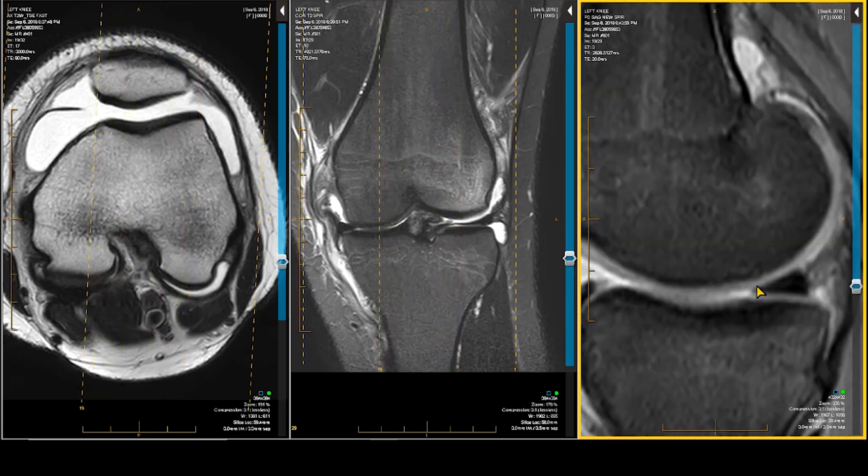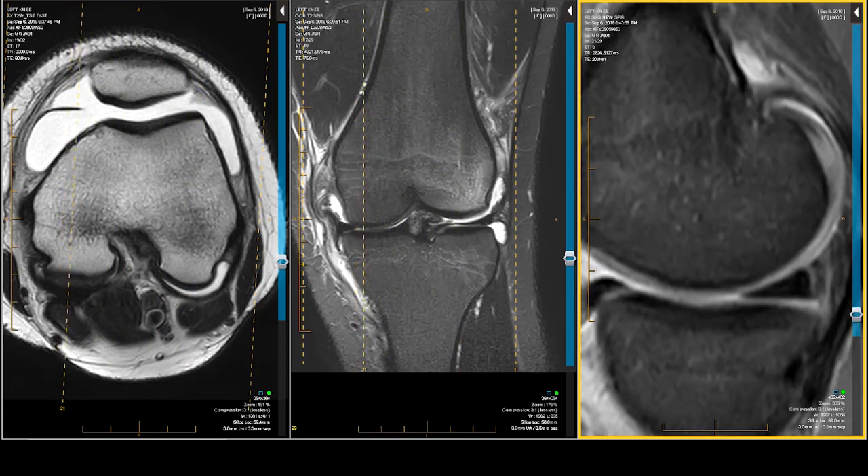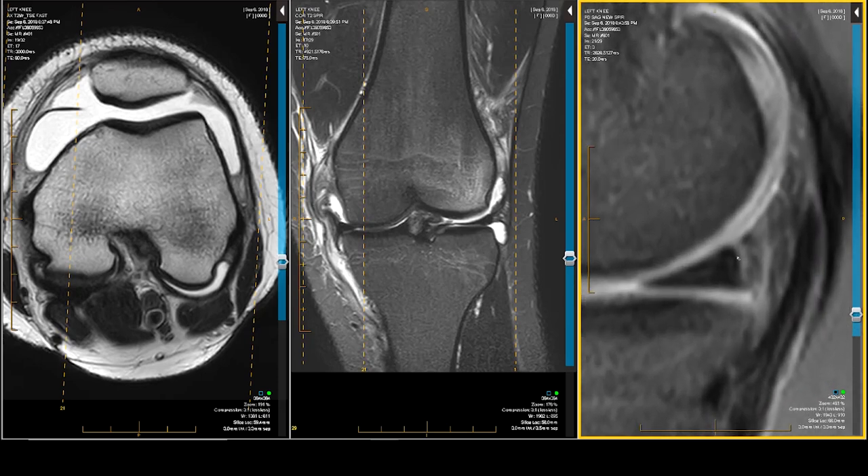Let's go over to the medial side. Let's blow this one up. If you look very carefully, there is swelling in the capsule — this is all of the capsule right here. That line is an injury to the capsule, and that is a vertical tear right at the interface between the meniscus and the capsule, virtually going from top to bottom. This is a ramp lesion.